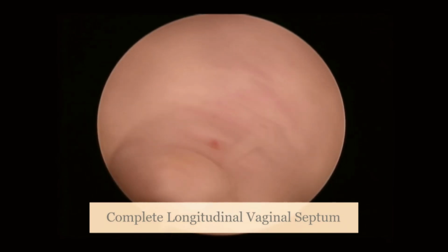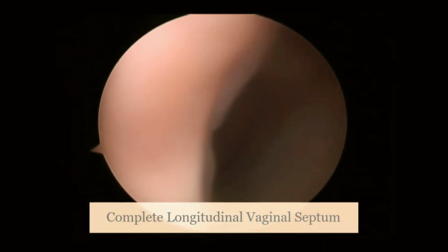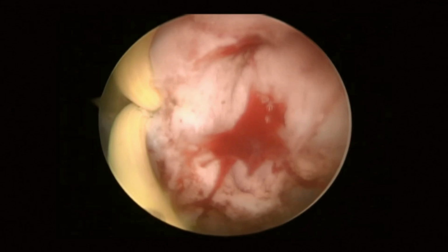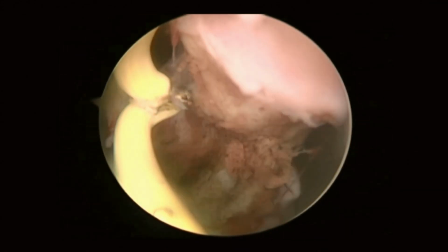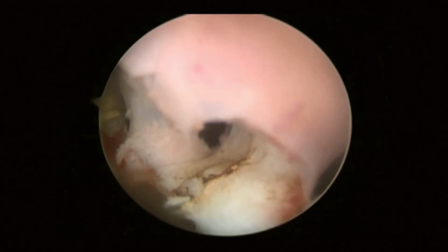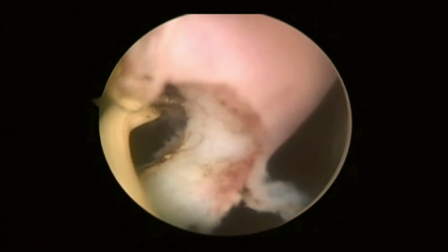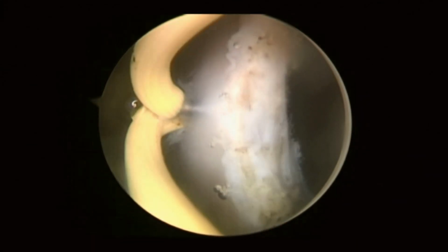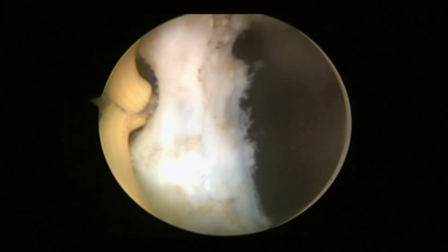Here this can be easily dealt with your pencil cautery. You can just put the speculum, one on the anterior wall, one on the posterior wall, and with the pencil you can cut the septum till the cervix. But just to show, I have done it with a monopolar hook using glycine. Here the vaginal septum is being cut.